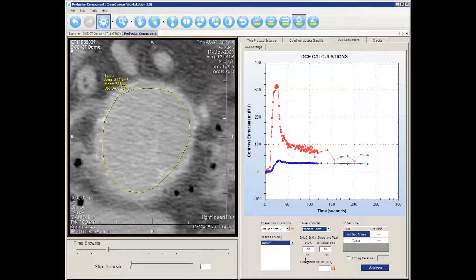Verify or change the time period for determining the initial area under the curve. Likewise, verify or change the time period for determining the initial slope of contrast uptake. Enter the correct hematocrit value.